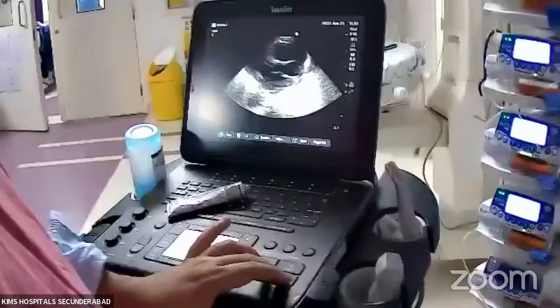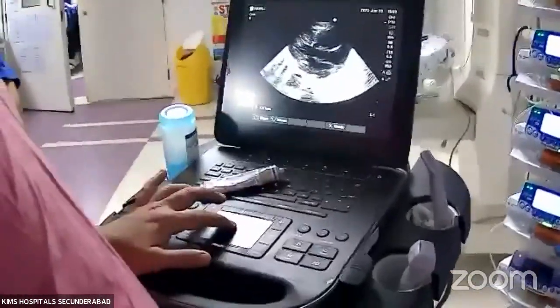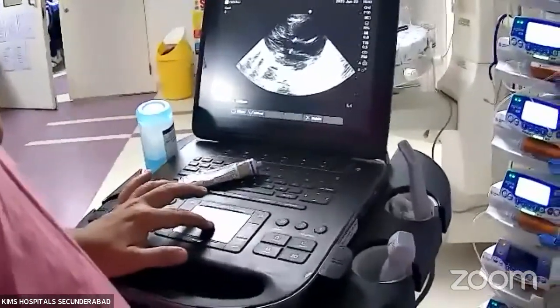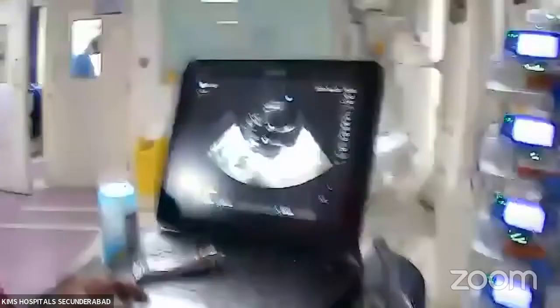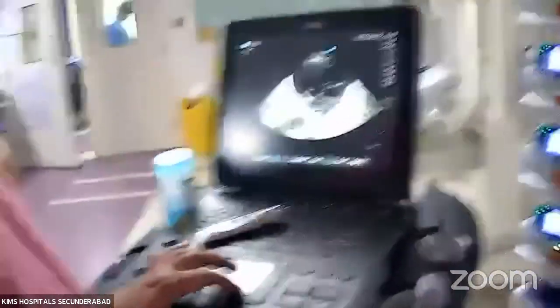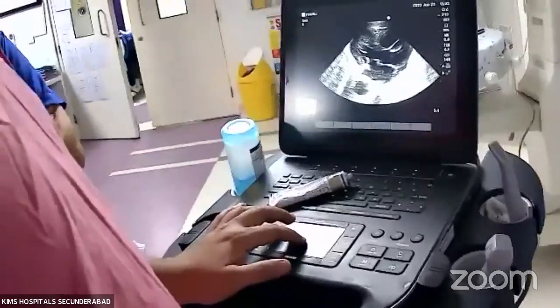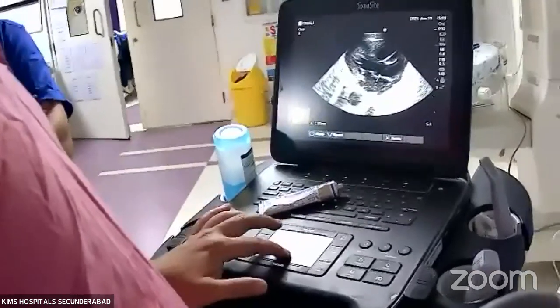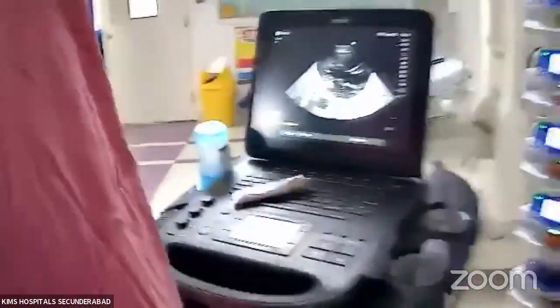And second, in the same way, is the LA to aorta ratio. There are two ways to do it. Either do it separately. One, the valve should be open for that, it should not be a closed valve. Then all you know how much it's coming. We already told it's coming 5.8. And then the LA should be measured in the closed aortic valve and aorta should be in the open aortic valve. See, this is the maximum. So 6 was there, and now this is the LA, 10. So 6 by 10, that means it's around 1.6.